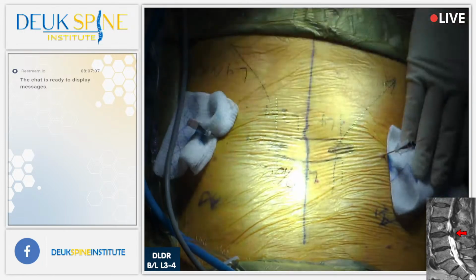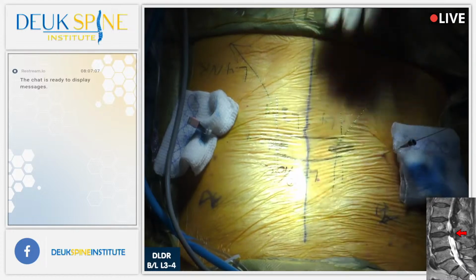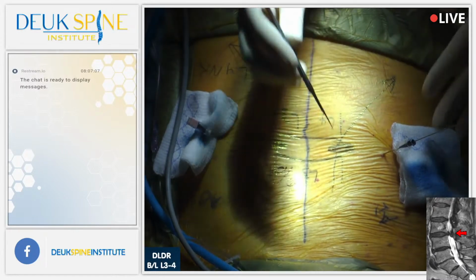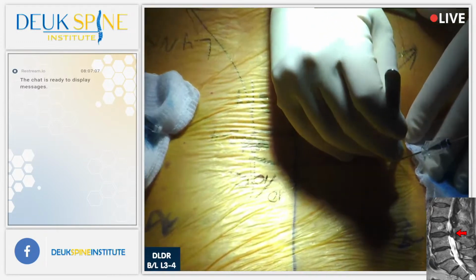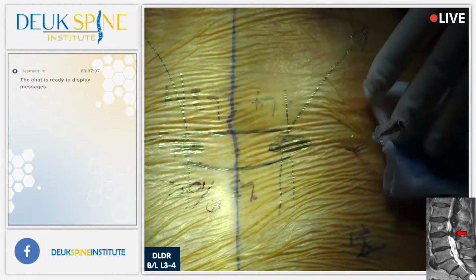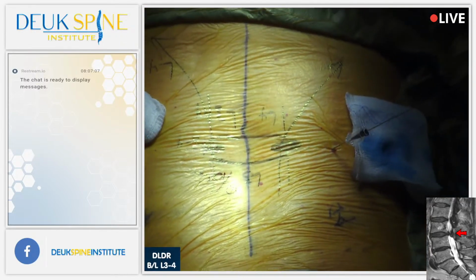All right, now, this patient doesn't have blue blood. He bleeds just like the rest of us, but this is a bloodless surgery. So that's another advantage of this procedure, it's bloodless. We've already numbed up the skin, and we're ready to make our 7mm quarter-inch incision. The whole surgery, folks, is done with this tiny incision. That's it. And there's no internal damage to his body.